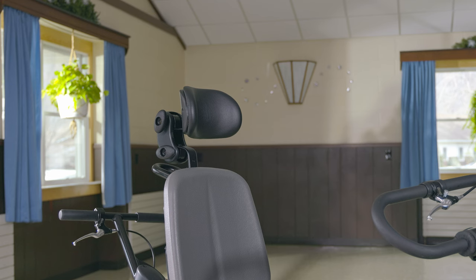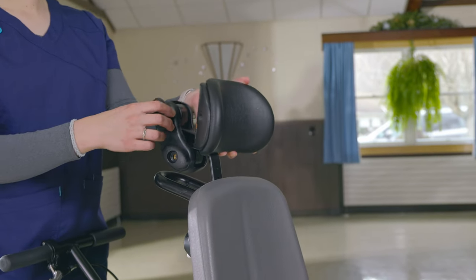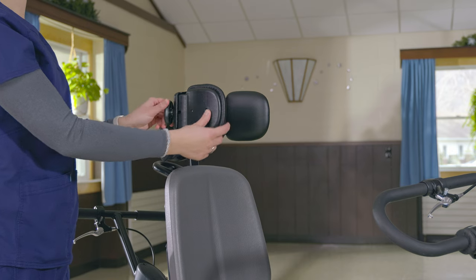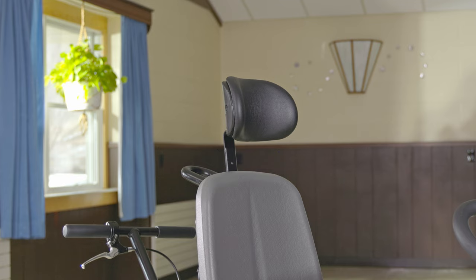There are four styles of headrests. The contoured headrest adjusts vertically with a button, and we can move it forward and backward and set the angle with two knobs. The flat headrest has the same adjustments. The winged headrest also offers adjustable lateral support with side pads, and we can swing them back to make a wide, flat headrest. Last is a simple contoured headrest that adjusts only up and down.